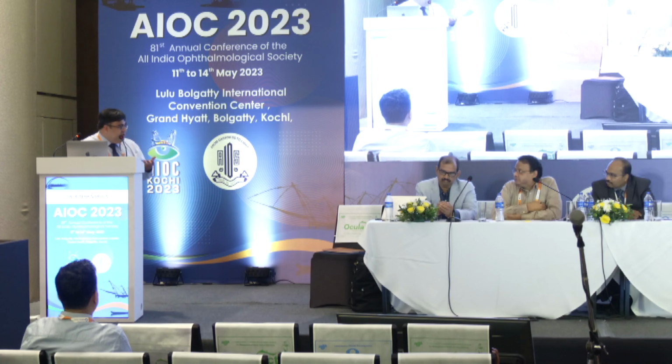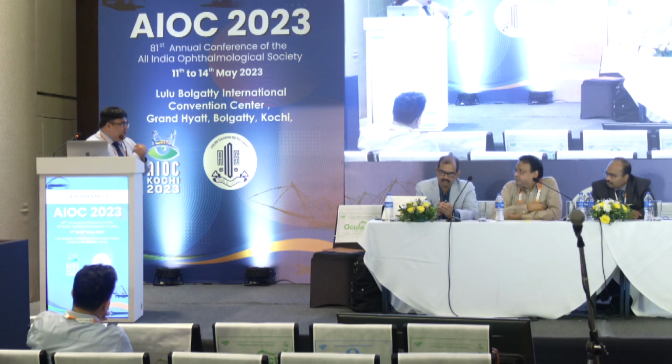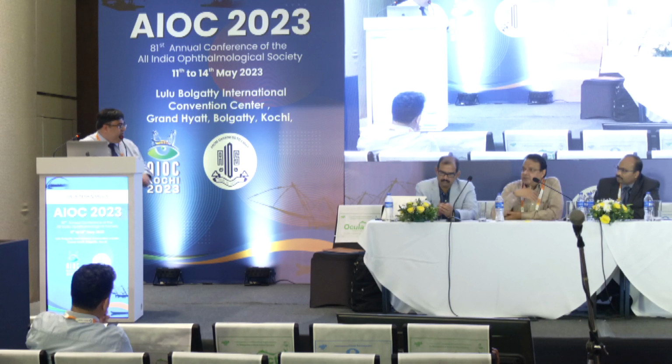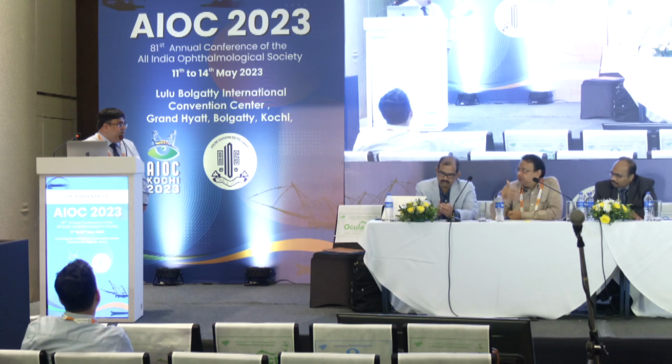It depends on the patient's fixation also. And the more the retina is compacted, the more the number of artifacts tend to increase. And which machine, if somebody in the audience has to buy a machine, what should they look into to buy that machine?